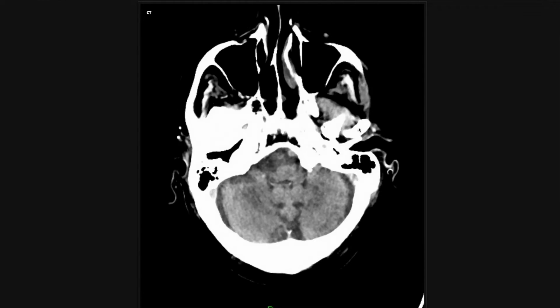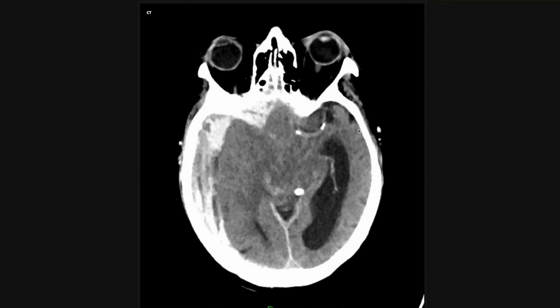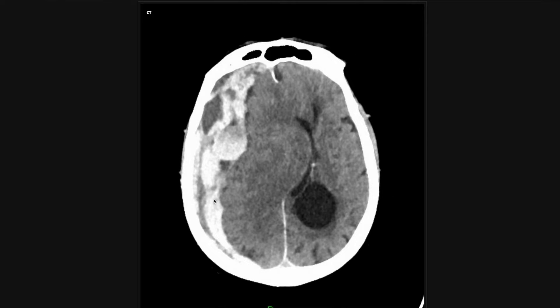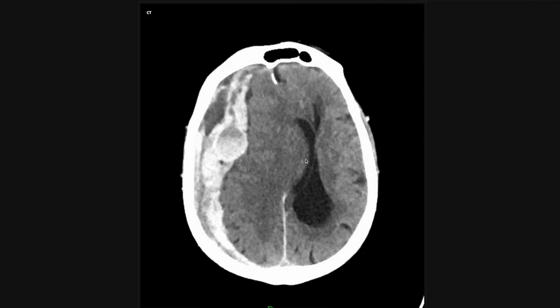This is a companion case — this one is not subtle whatsoever. This is another subdural hematoma with extensive complications related to mass effect. This hyperdensity along the right cerebral convexity is obviously all blood — a subdural hemorrhage. It has that crescent shape rather than a biconvex shape, which would be an epidural hemorrhage. When they get this big, you start to worry about mass effect: the skull is a relatively enclosed space, so if you have expanding hemorrhage, the brain parenchyma is pushed aside. The right lateral ventricle is being significantly compressed by the hemorrhage, and there is also shift of intracranial contents across the falx into the left side of the cranial vault.